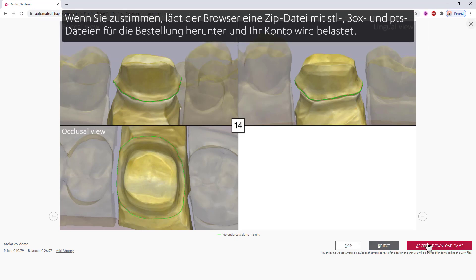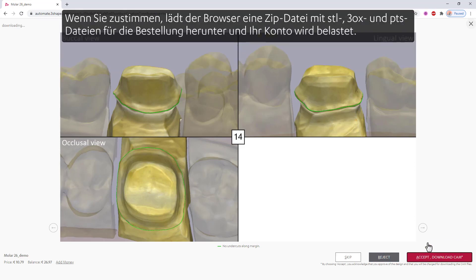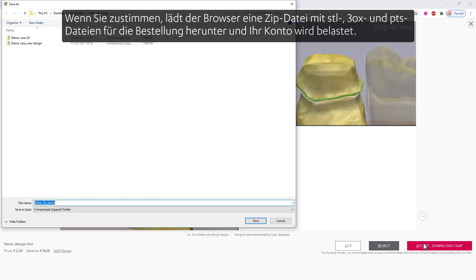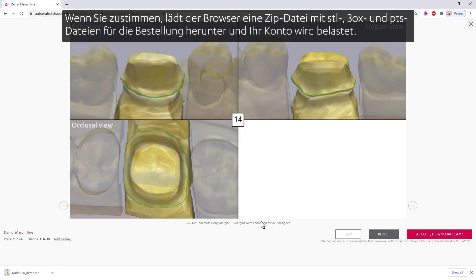If you accept, the browser will download a zip file with STL, 3OX, and PTS files for the order, and your account will be charged.